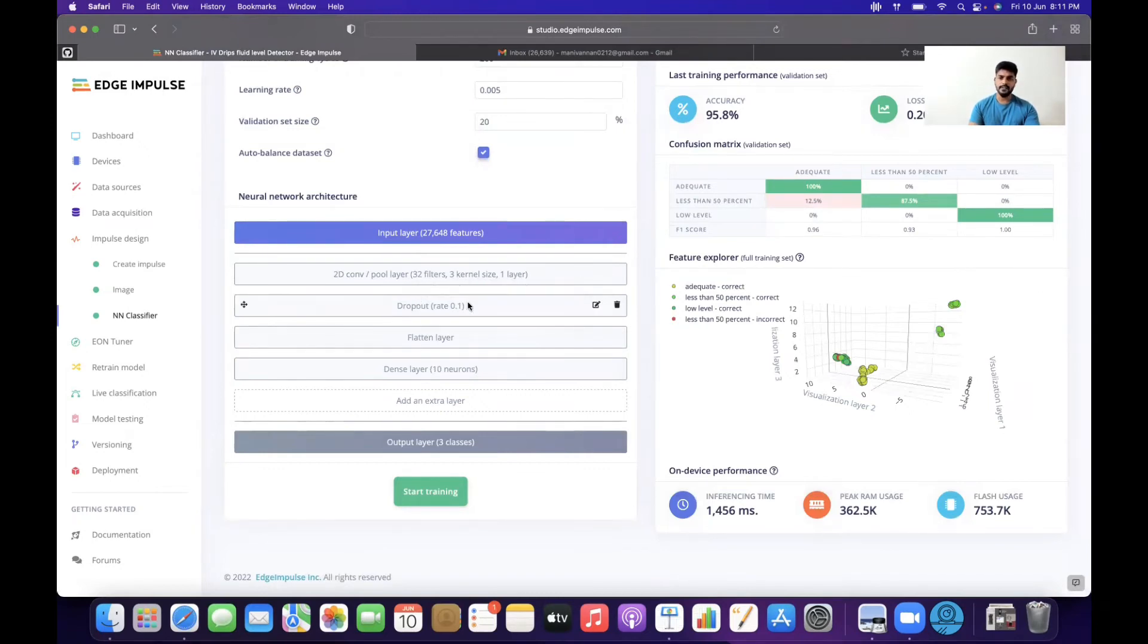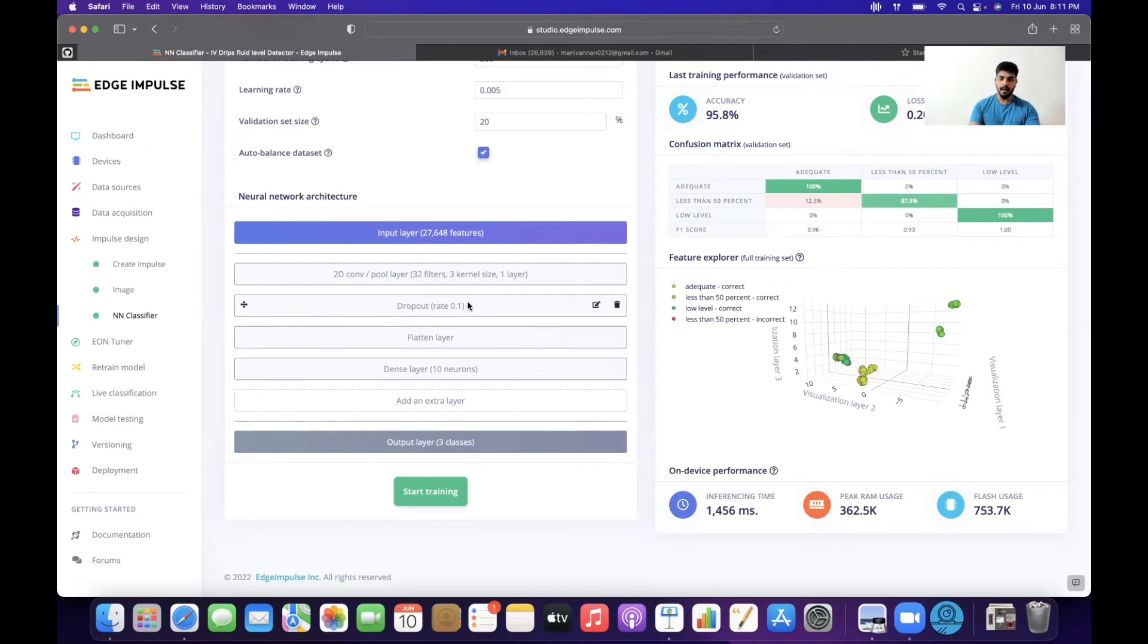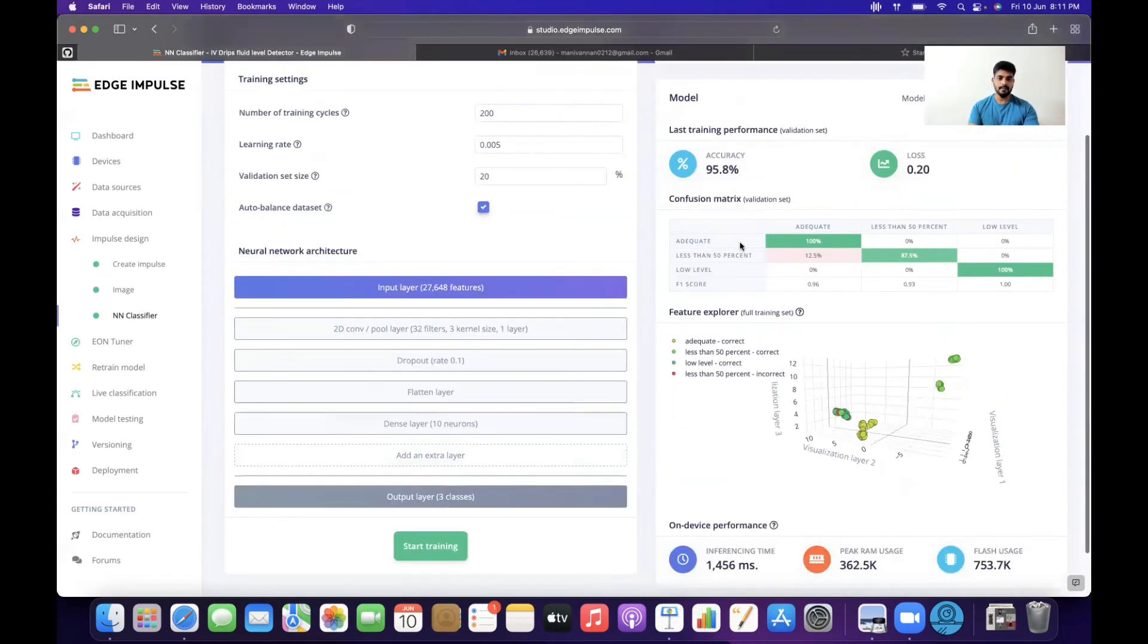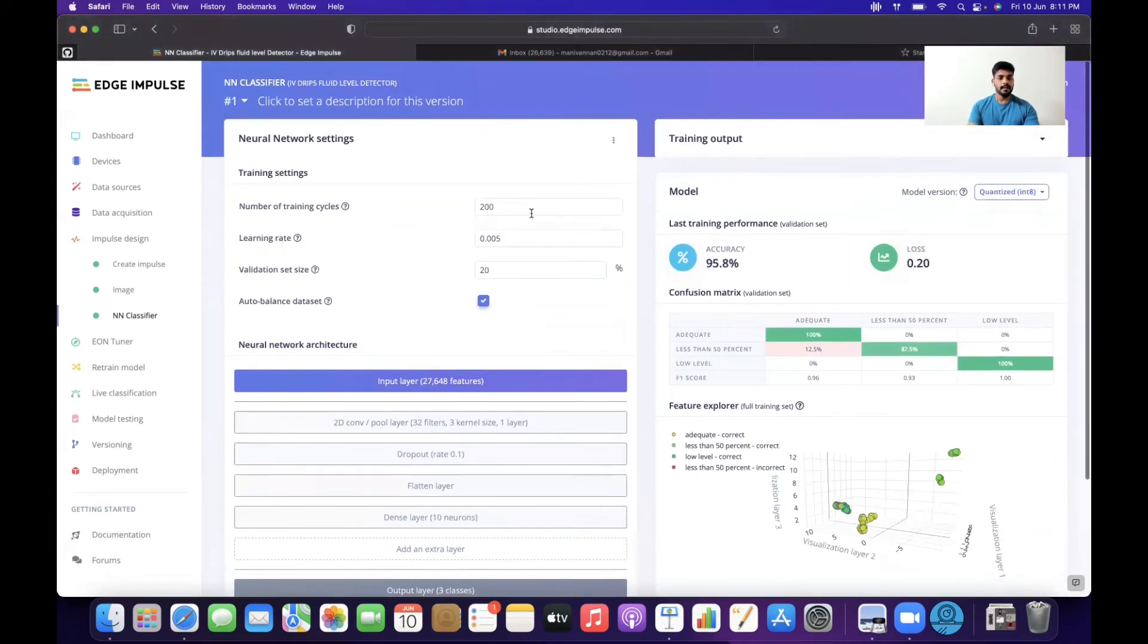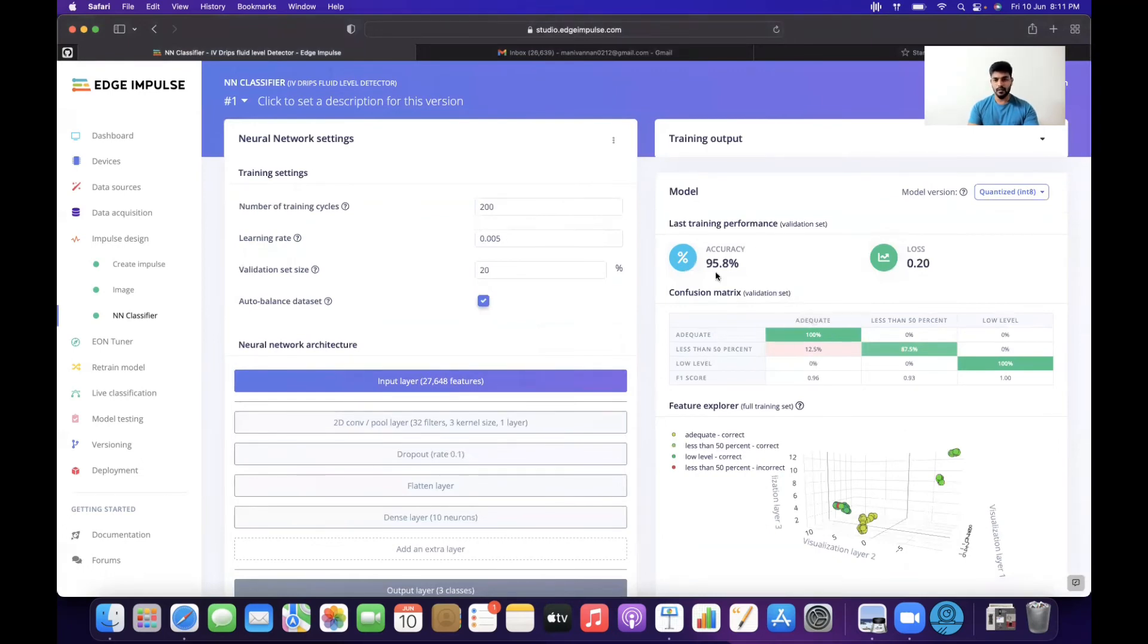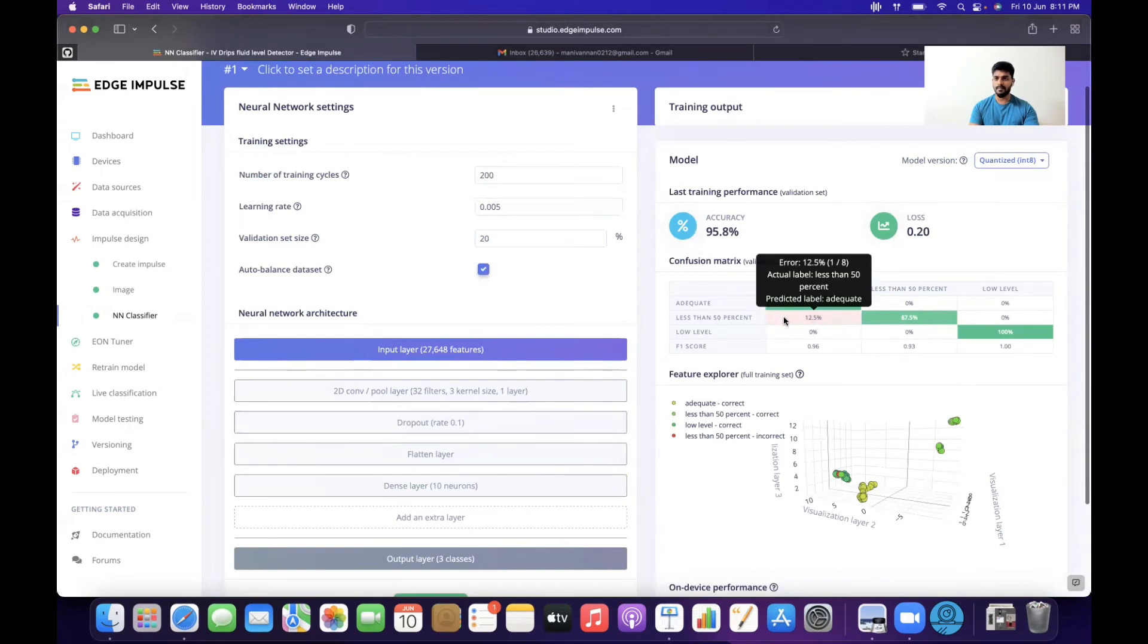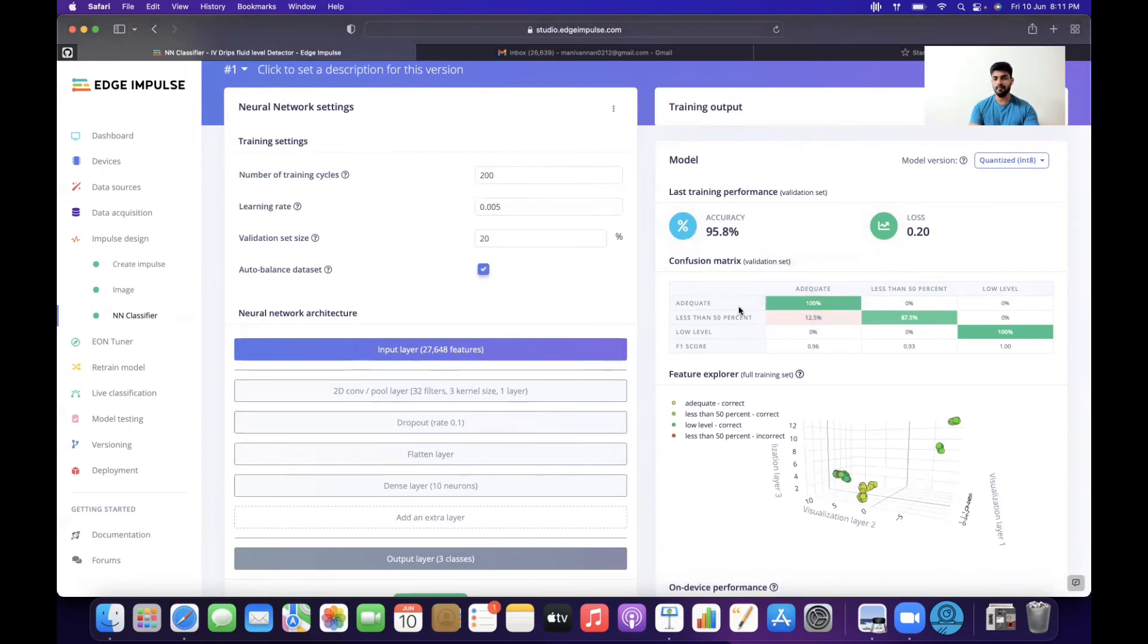I used a 2D convolutional layer with 32 filters, kernel size of 3, and dropout of 0.1 to avoid overfitting. I used a flatten layer and a dense layer of 10 neurons. The output layer has three classes. Training cycles: 200, learning rate: 0.005. I achieved accuracy around 95.8%. There are some cases where due to lighting differences, less than 50% is sometimes classified as adequate. Once the model is trained, I went to the deployment section and selected Arduino Portenta.